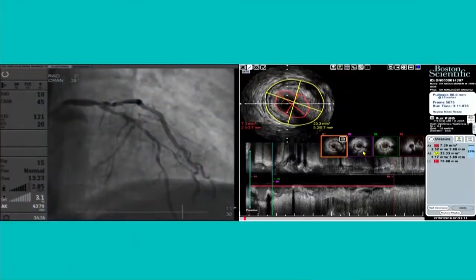Angiographically, I'll tell you, up to the diagonal there is disease, and just after the diagonal there is minimal disease, which is actually, I really don't know. You may be landing a stent exactly up to the septal artery, maybe one size, from the septal to the diagonal or just distal to the diagonal will be another size. There are two stents to be used in the LAD. So 3.5 in the proximal LAD, 2.5 to 2.75 in the distal LAD.